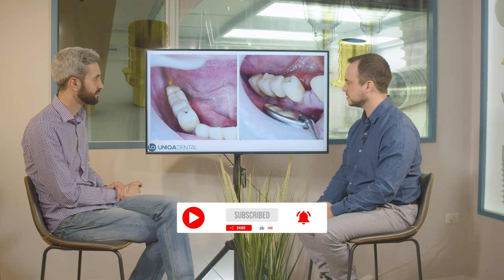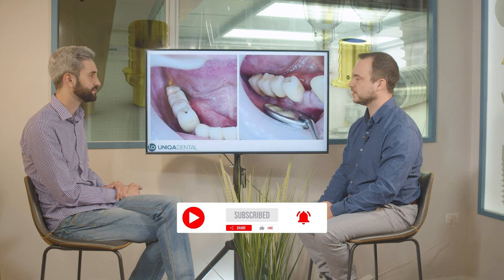An interesting case in the field of dentistry. Here we have a bridge on implants — on four implants — a four-unit bridge that was made a very long time ago.